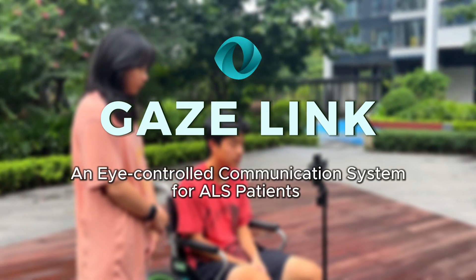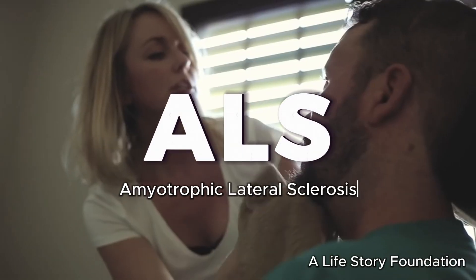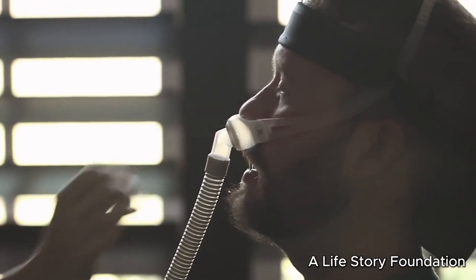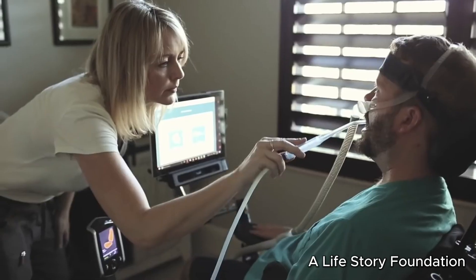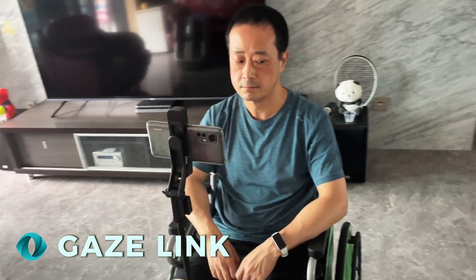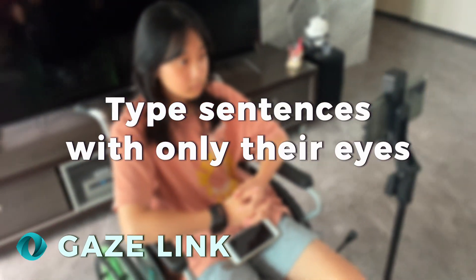GazeLink is an eye-controlled communication system for ALS patients. ALS is a devastating disease that gradually takes away someone's ability to move and speak. Some patients can only use their eyes for expression. Therefore, I developed GazeLink, a free multi-language mobile application that helps ALS patients type sentences with only their eyes.